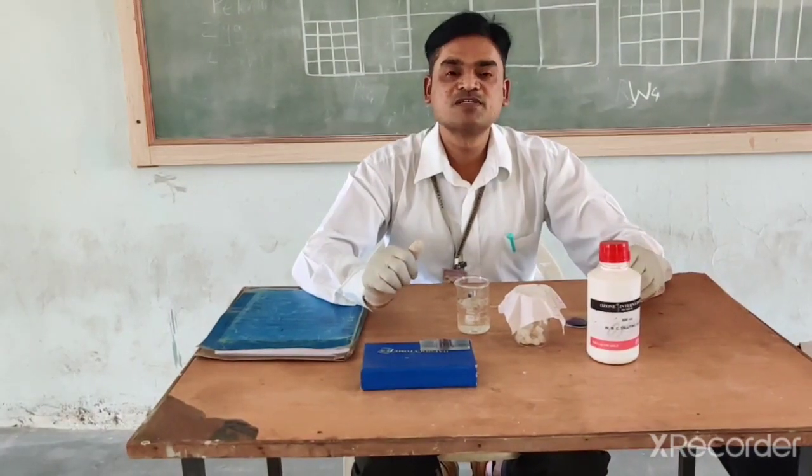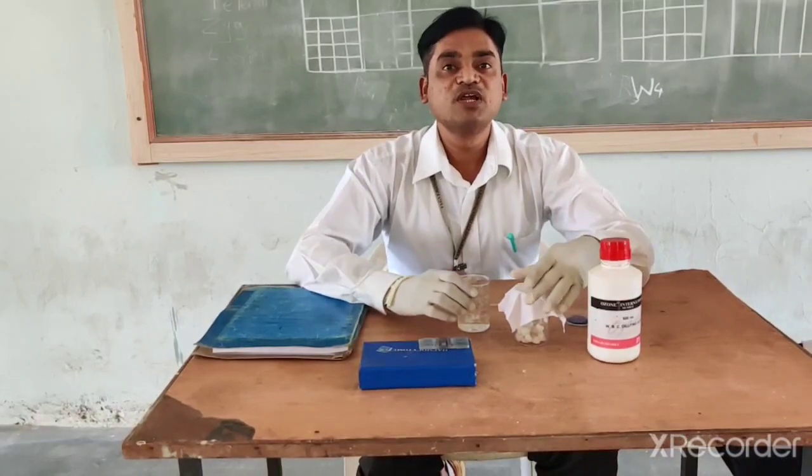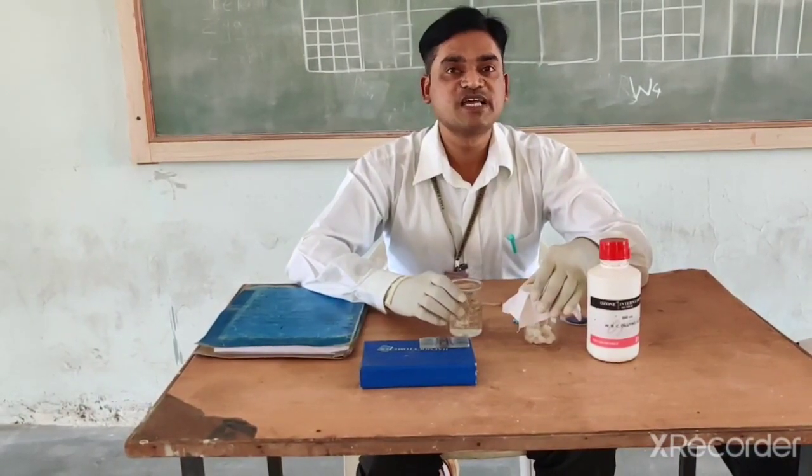Good morning students. My name is Dr. Ganeshav Javan. Today we will do the demonstration of practical estimation of WBC count.